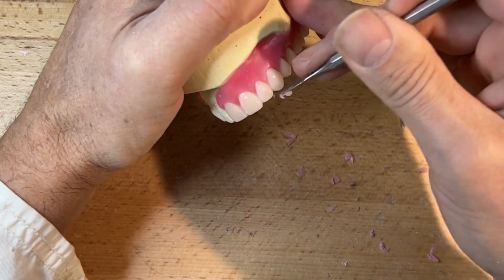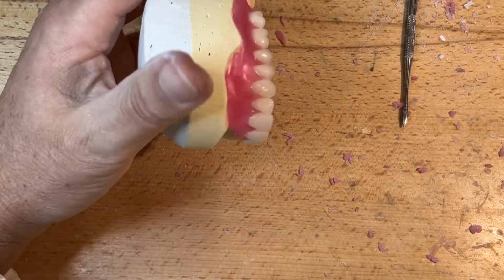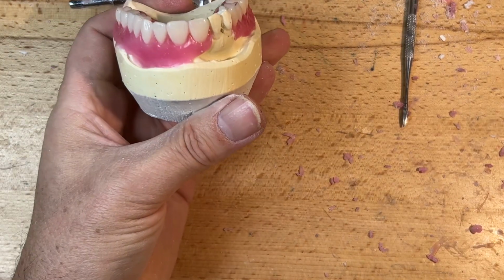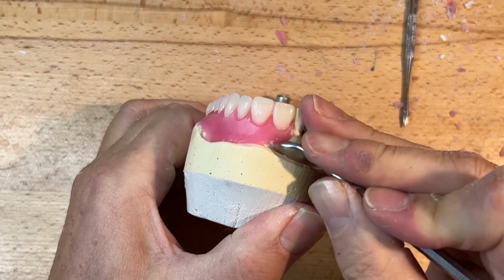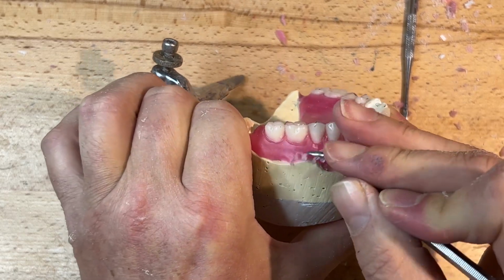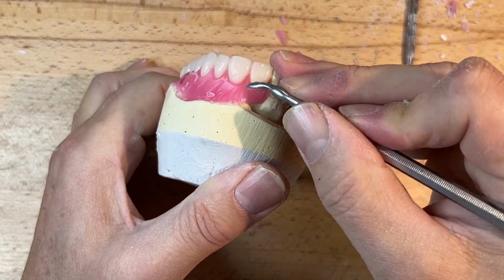obviously we don't want any wax on the teeth, so I'm taking some wax off the teeth, and at the end I'll probably go over it with a touch of wax solvent. And then I'm going to go over here, reduce a little bit more. So now I'm just getting the length of the teeth, and then I can go in here and reduce the width of the flange and maybe shape some festooning, stronger canine. I've got some frenums here to deal with after I take it off. You want to leave a little incisive papilla, you can.